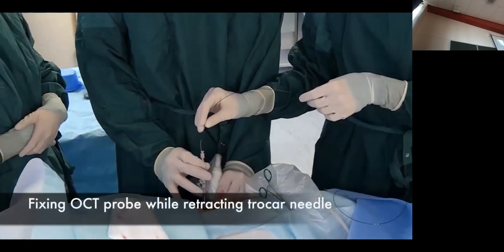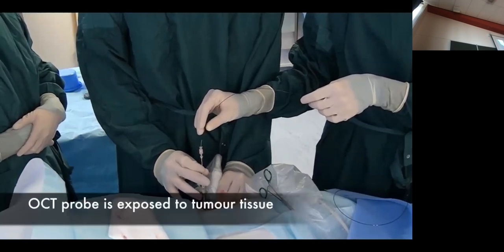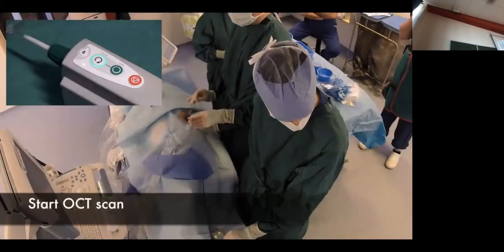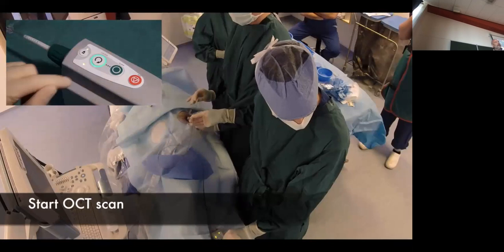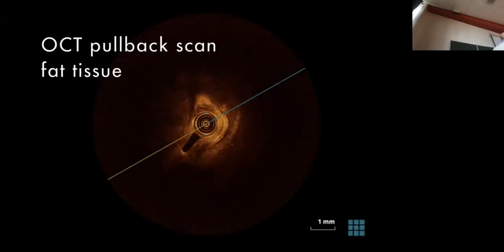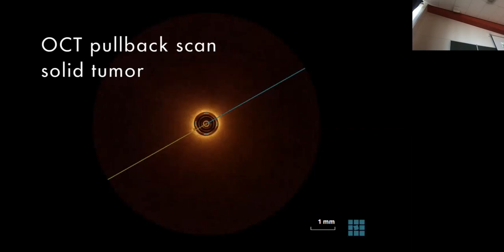Again, the patient is on the inside. So we can bring in this OCT probe. We retract the metal trocar needle, because we cannot look through metal. But the OCT probe is still in the tumor, really in the mass of the tumor. And we start running it, and we get a data set like that. You can see the beautiful structure there, and suddenly it's noisy.